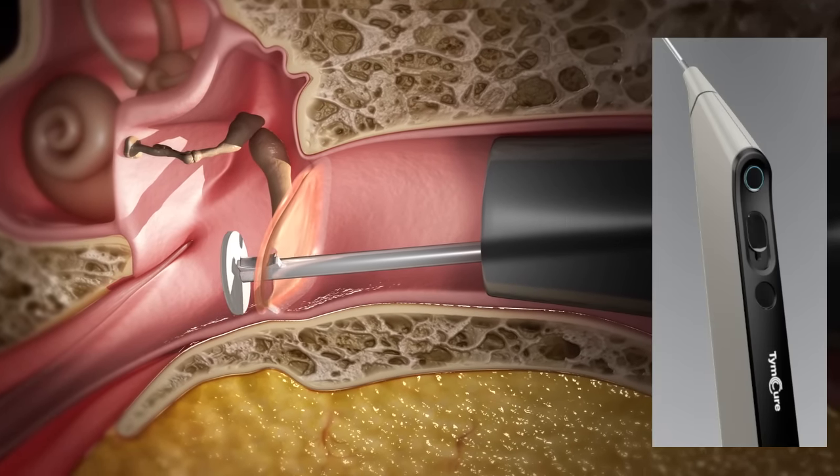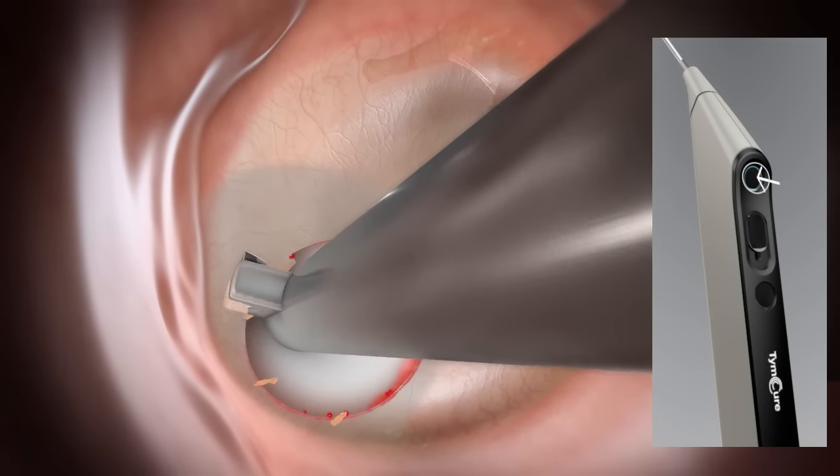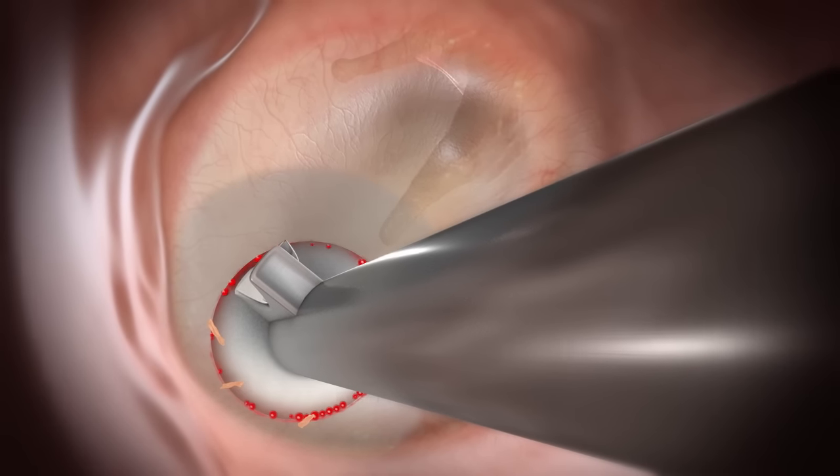The knife turns along the perforation's edges for debridement. The knife and the outer graft are retracted whilst the inner graft remains medial to the tympanic membrane.